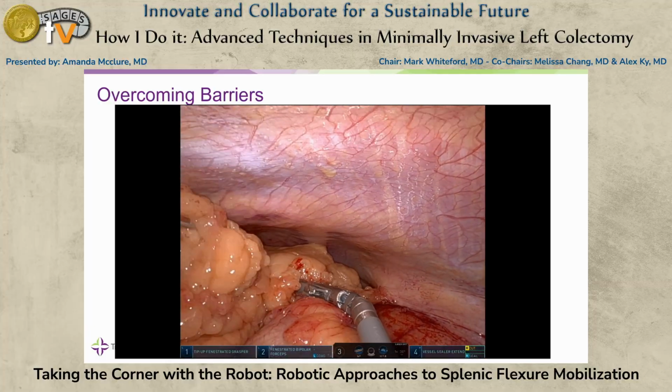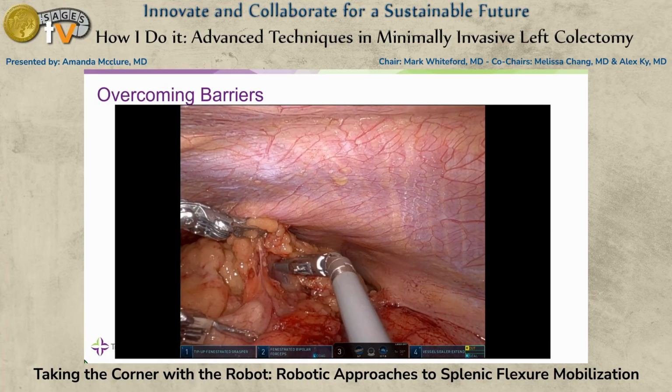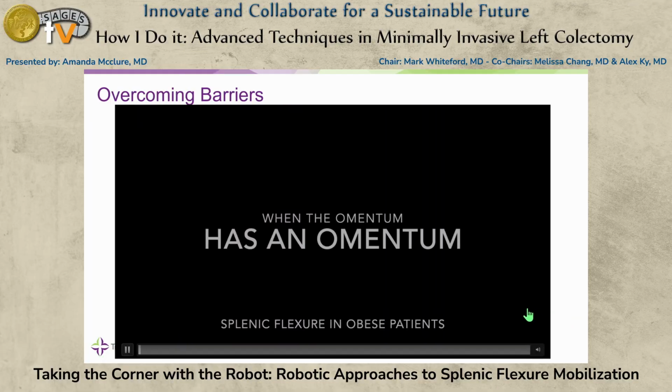So anything you can do to free everything up and then pull the colon out toward you is going to make it easier for you to be able to see. So those are some of the things that I've learned.